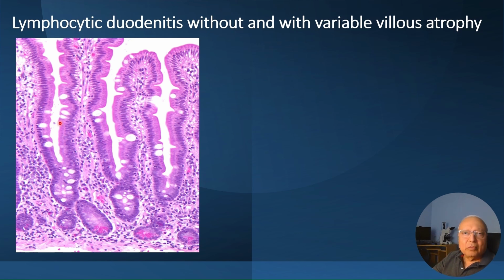So you have to measure a certain length of the enterocyte epithelium or lining to ensure that the lymphocytes are either elevated or not elevated. And it's best to see a monolayer like this, where you can appreciate the lymphocytes better. Also notice that there are certain numbers of chronic inflammatory cells physiologically present in the lamina propria. And pathologists generally have an idea of what is normal cellularity versus what is elevated cellularity. And this is normal duodenum.